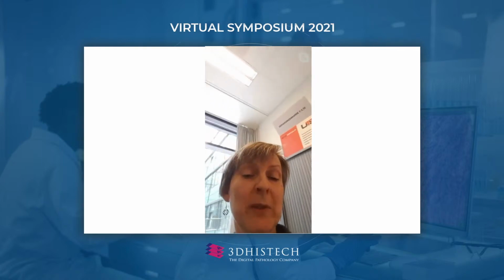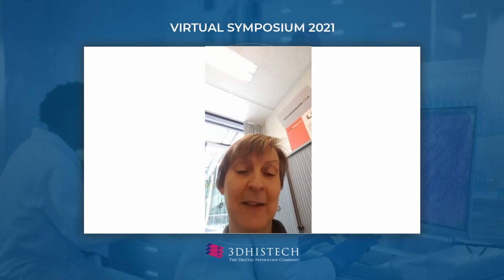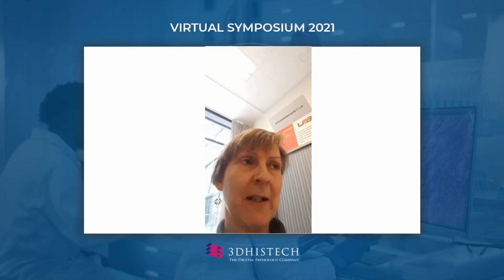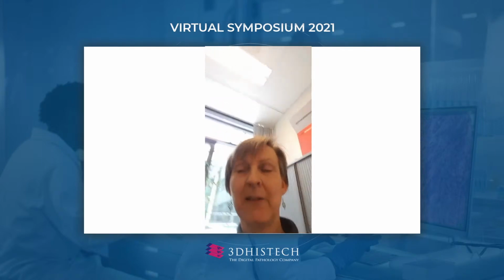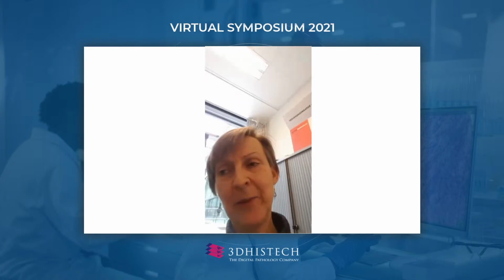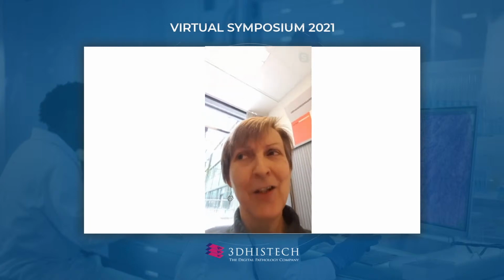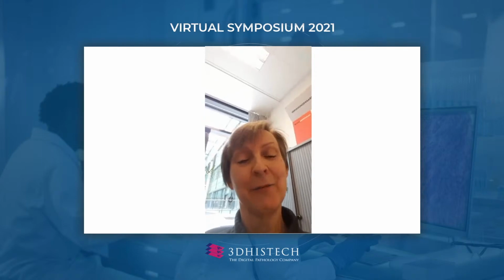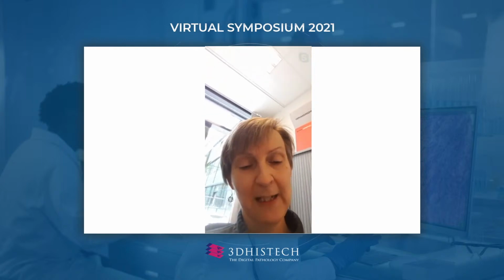And what we do is we scan all our slides with 40x. And now we are discussing whether maybe for the longer storage to go down to 20x. And I compared several of my bone marrows with 40x and 20x. And to be honest, I don't really see a lot of difference. So probably 20x is for many diagnostic purposes also good enough. But we decided to be safe and to do 40x.